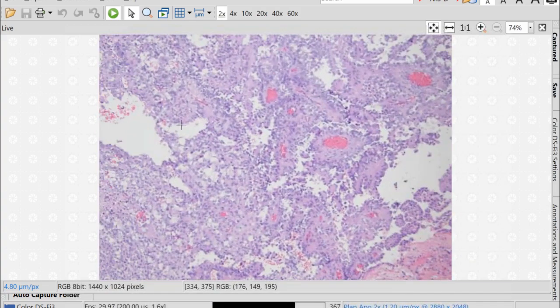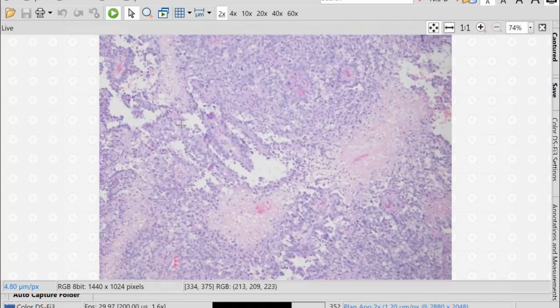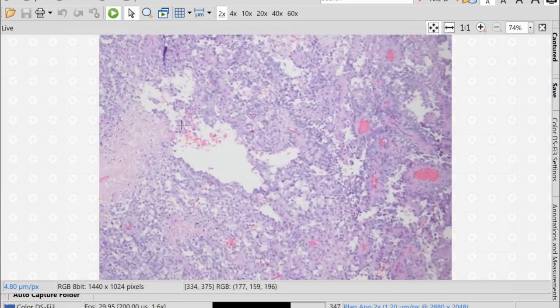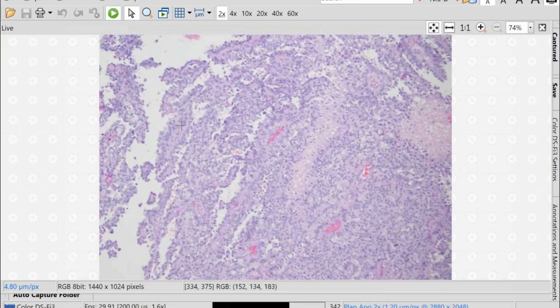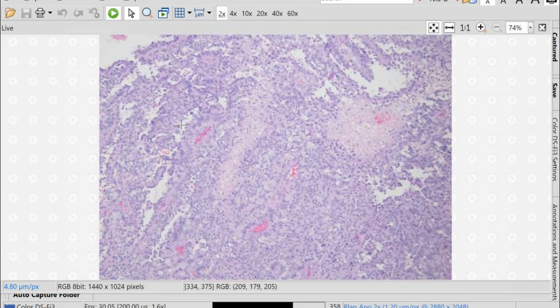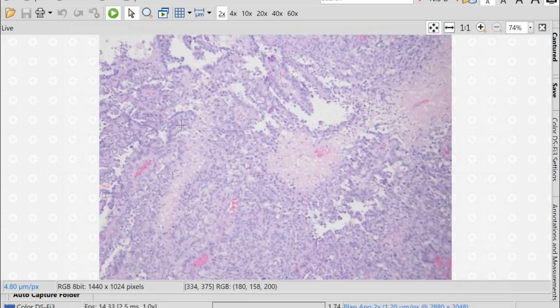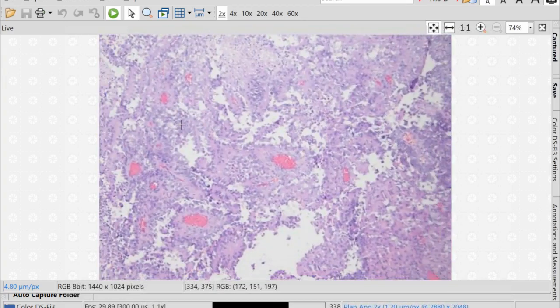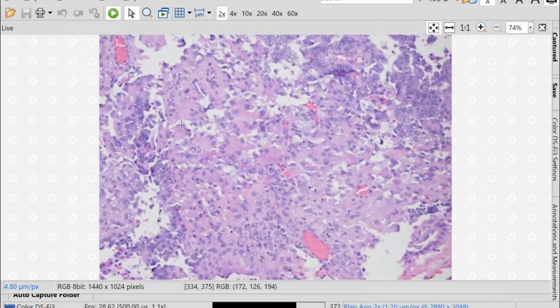There's this case. And this looks different from the other lesions that I've been showing you. You have some papillary architecture, but areas that appear a bit more solid. You're starting to see necrosis, patchy necrosis. That's worrisome in these tumors when you start seeing necrosis to this extent. And then you start seeing pink cells.